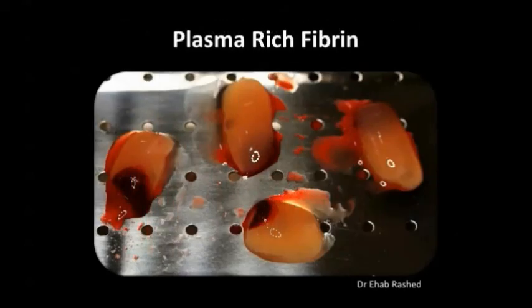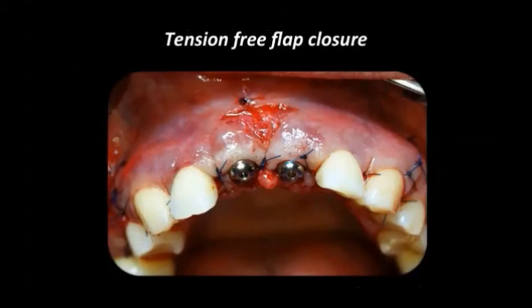And we also use the PRF membrane that we take from the patient's blood. Sometimes I use it, sometimes I don't, but in this case I used it. You take the blood, centrifuge it, and then you get this fibrin membrane that we can place on the site. It will accelerate the healing. It has natural growth factors. And then we suture the flap after releasing it.